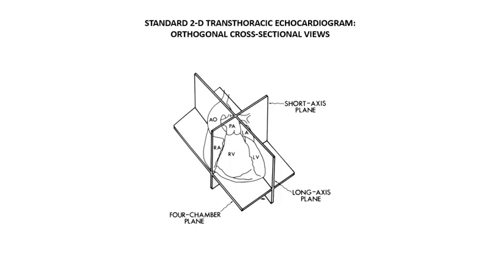In terms of interpreting our anatomy, we have similar but different problems in terms of recognizing our intracardiac structures. This is an example of what you either already know or will know in detail very soon. It's a representation of the three basic planes of cross-section that you image when you do a two-dimensional transthoracic echocardiogram. It has three orthogonal cross-sectional views. You'll see this slide more than once, and it nicely shows you the orientation of the heart in a patient's body, but it doesn't lie in the same cross-sectional planes as a standing human body.